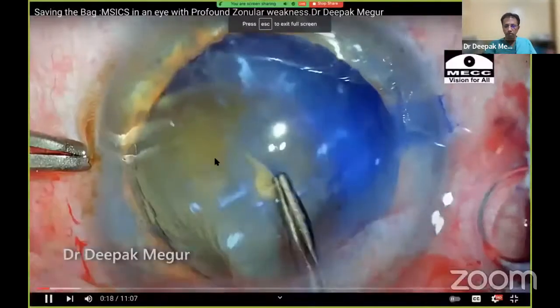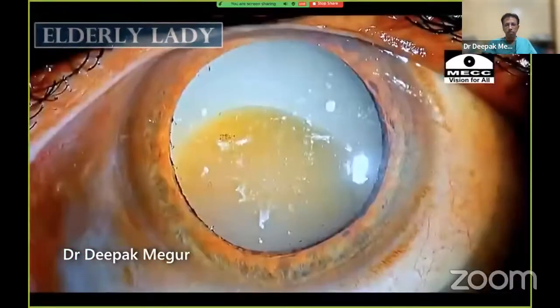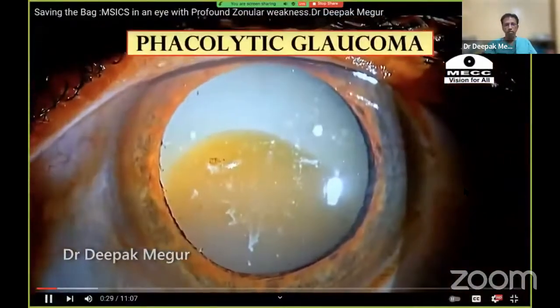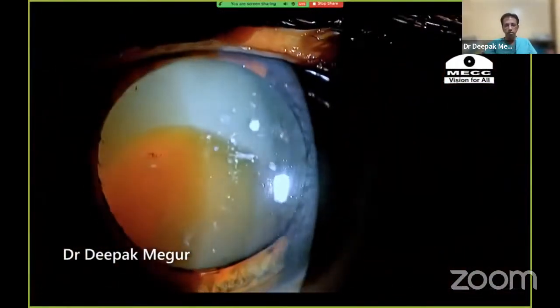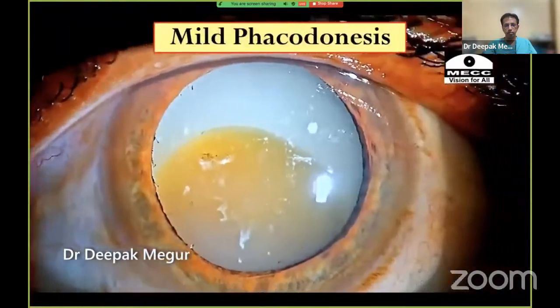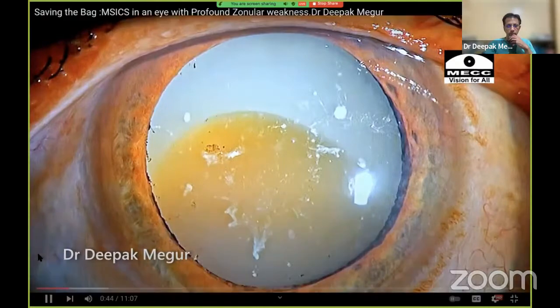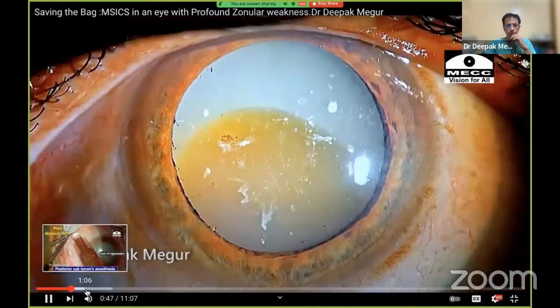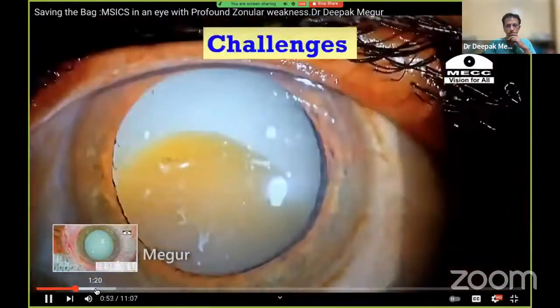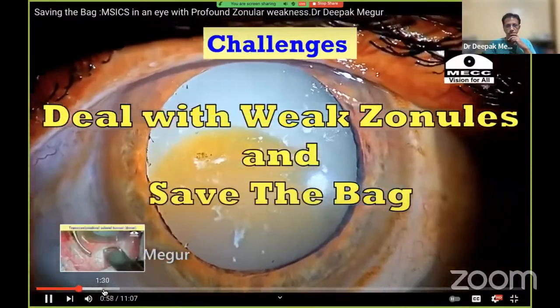In today's case, let's find out whether we can save the bag in this eye with extreme zonular weakness. This is an elderly lady with long-standing hypermature Morgagnian cataract with phacolytic glaucoma. Pressures are controlled and she's come for surgery. The capsule shows multiple areas of calcific spots. There is mild phacodonesis, and the hard Morgagnian small nucleus has settled down, surrounded by a pool of liquid cortex. I expect profound zonular weakness, and the challenge will be dealing with these weak zonules and whether we can save the bag.